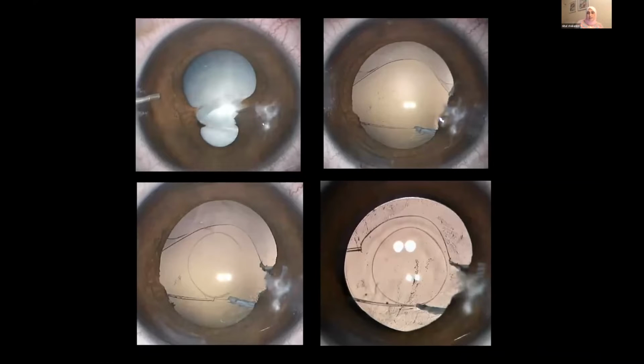So whenever we have a defect in the anterior capsule, we try to preserve any remnants of the anterior capsule. Even if it extends to both sides like this, we can perform the posterior rhexis and implant the IOL inside the bag despite having tears from both sides like that.